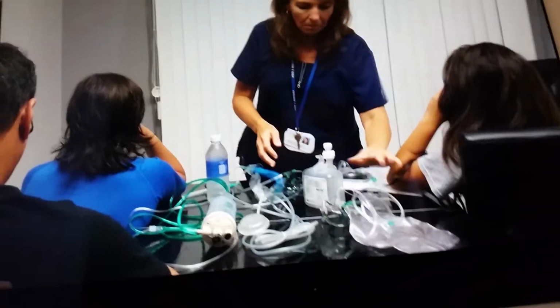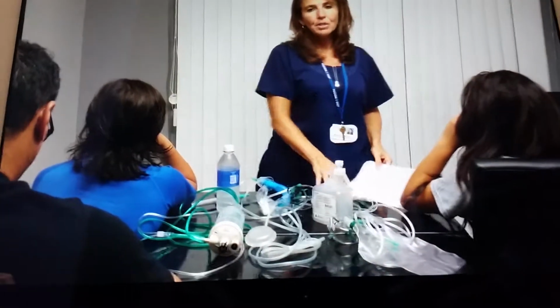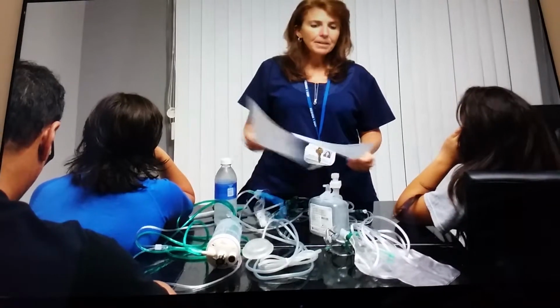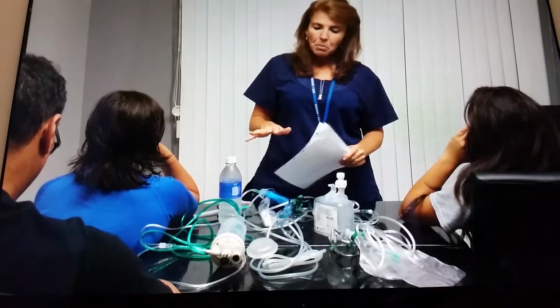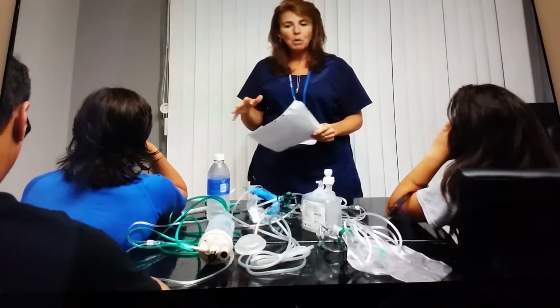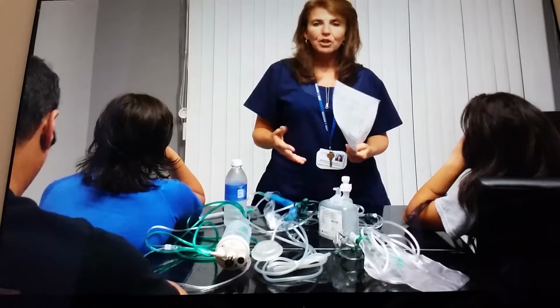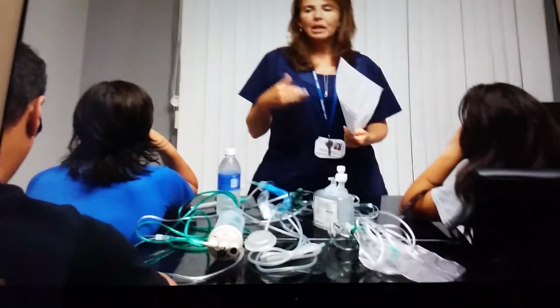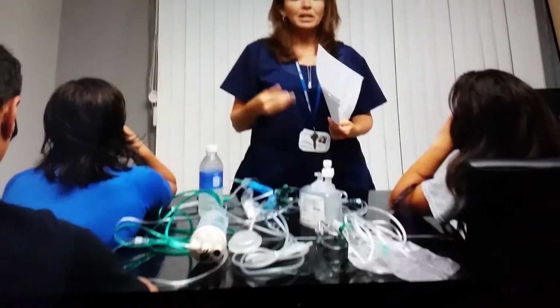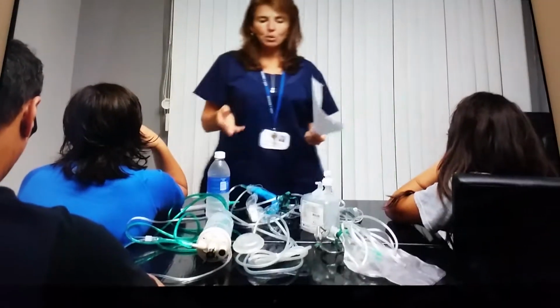Aside from our basic oxygen therapy, there are some safety considerations to be knowledgeable about. Basically, not so much in the home healthcare setting here in the hospital, but at home, patients that are going to go home on oxygen, we have to make sure that they're well educated regarding not cooking, not being exposed to any flames, any smoking, any sparks with electric devices or razors.